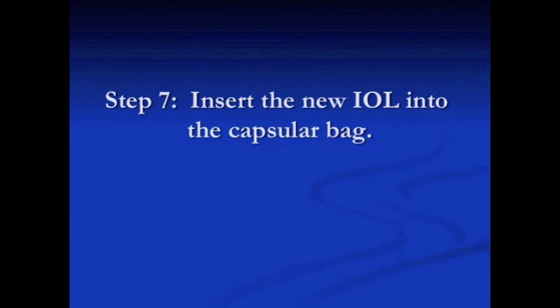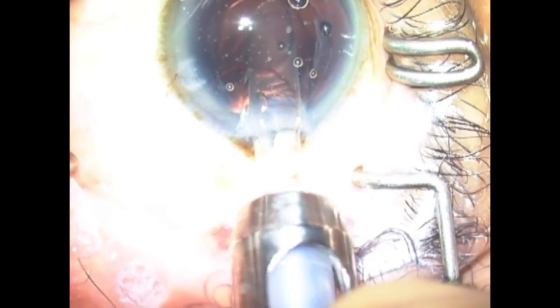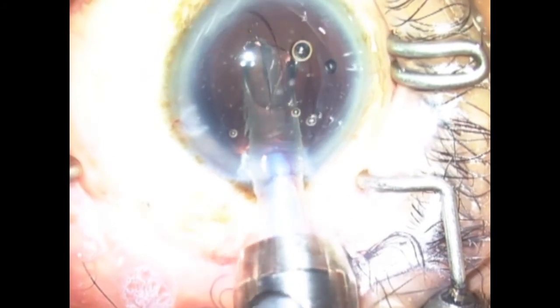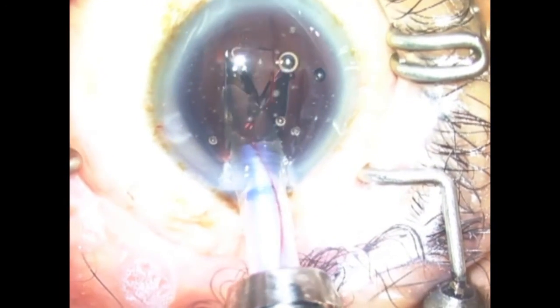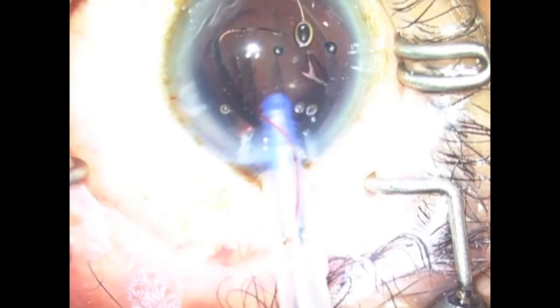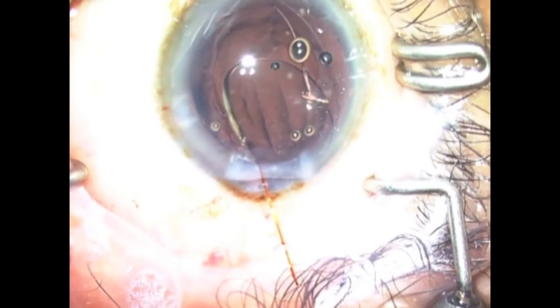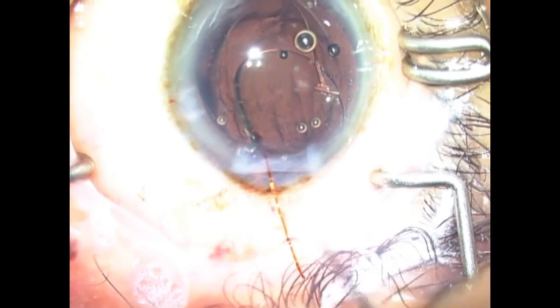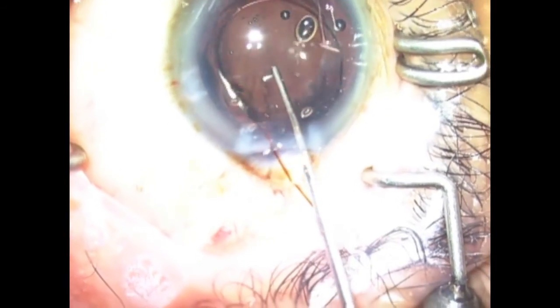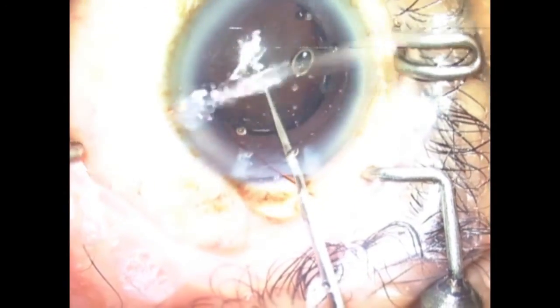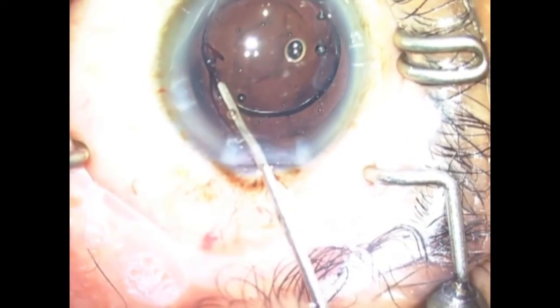Insert the new intraocular lens into the capsular bag. The lens haptics can be easily rotated into the expanded capsular bag.